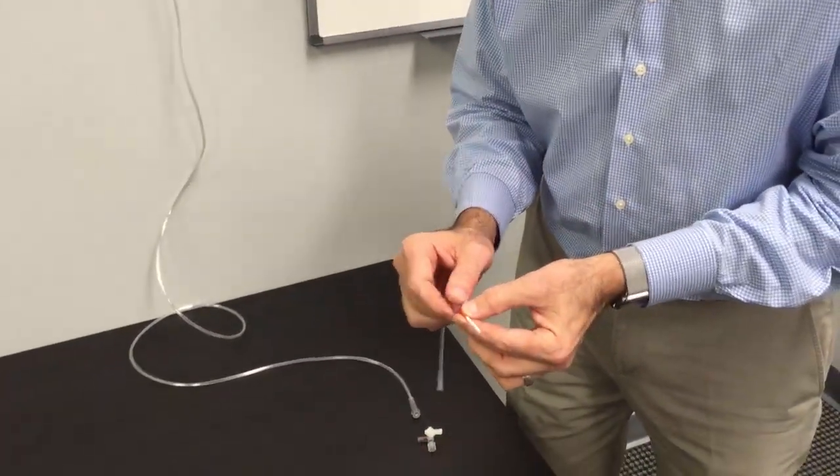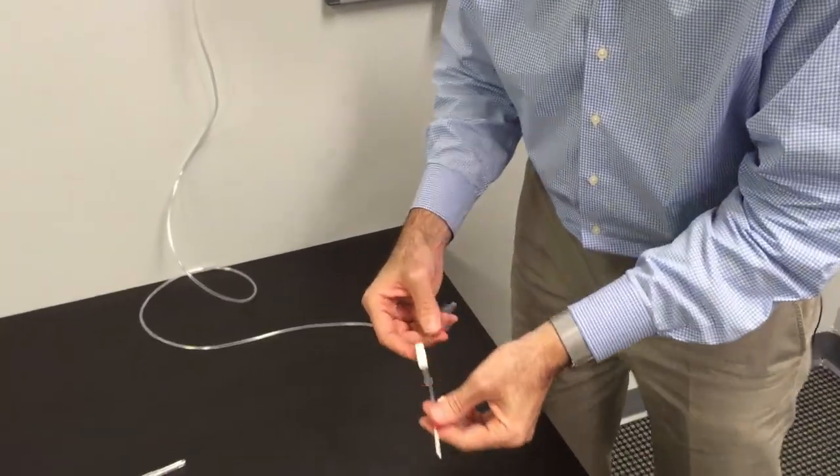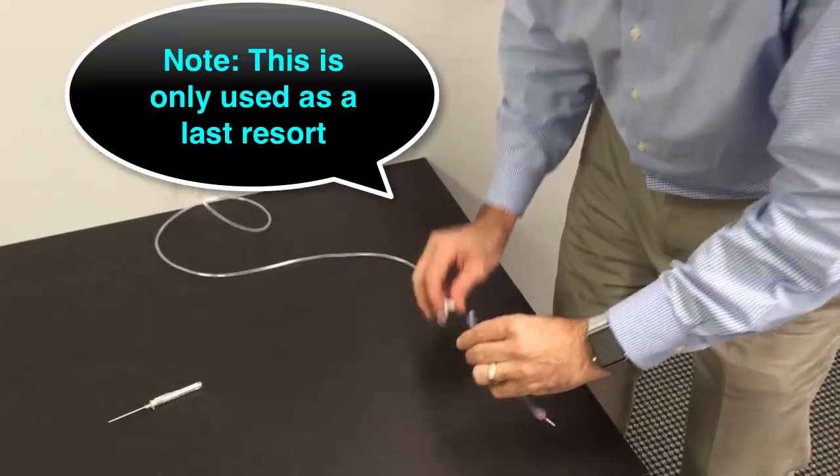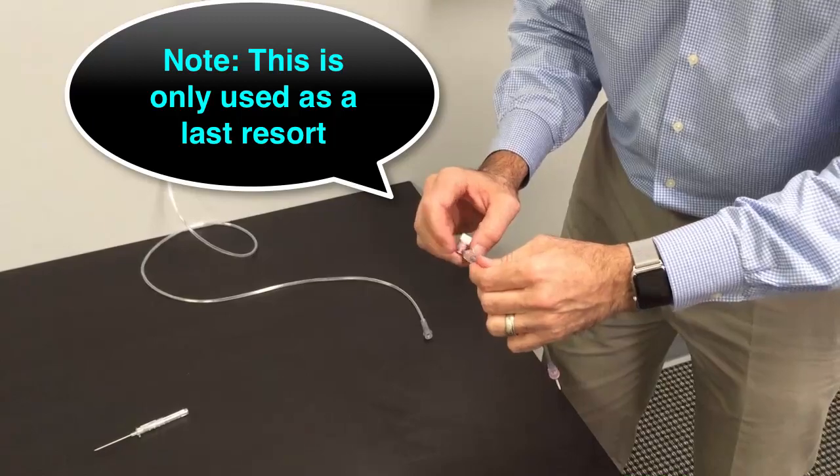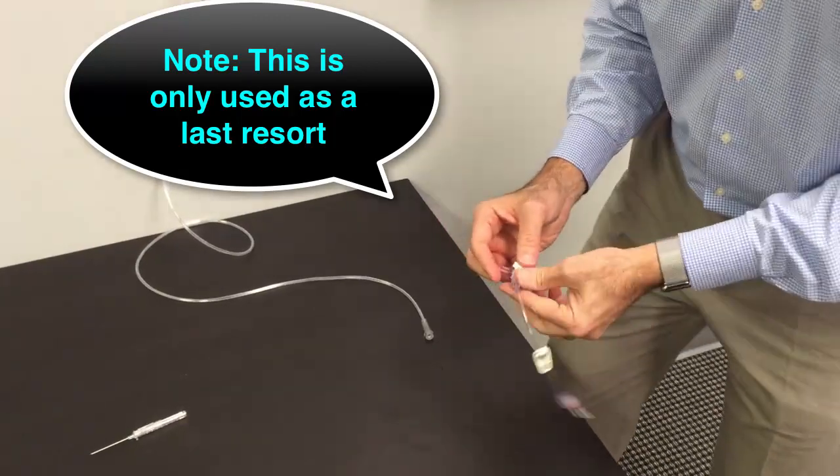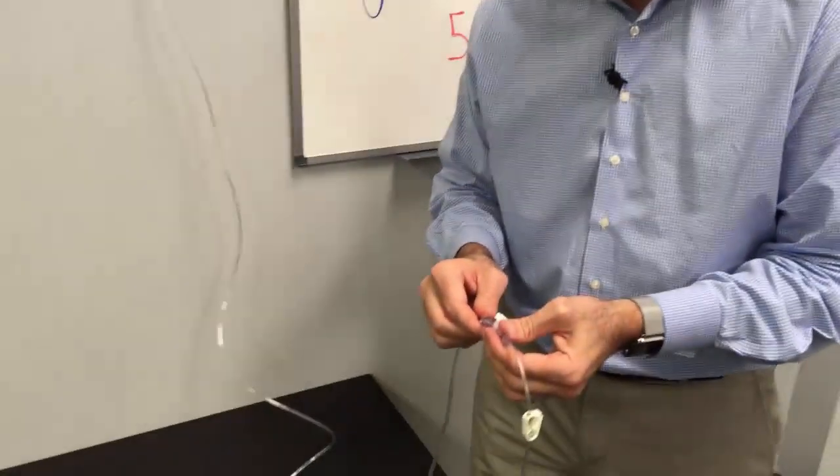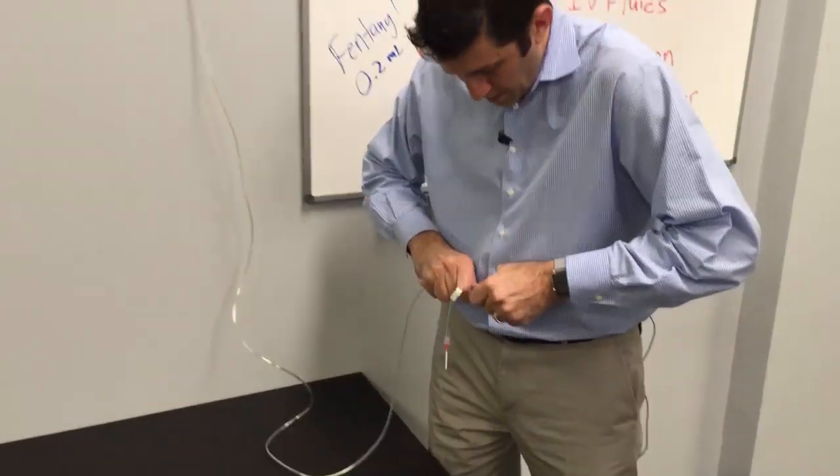You need the adapter. So this adapter will hook right up to that catheter. Now, you're going to hook this up right to the three-way stopcock here. And then you're going to hook that up to just basic oxygen tubing. So you have to squeeze that on really good.